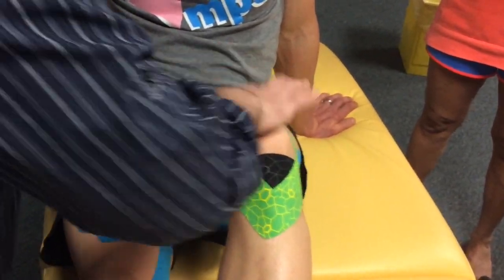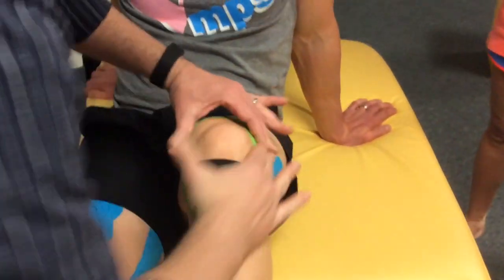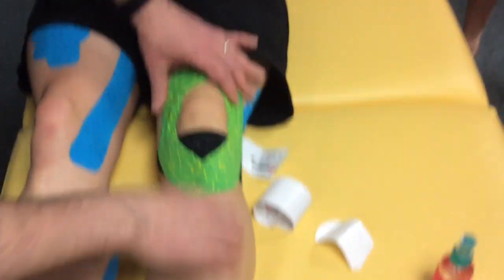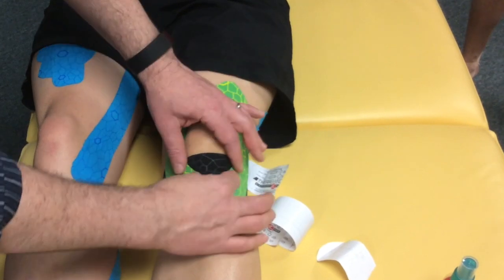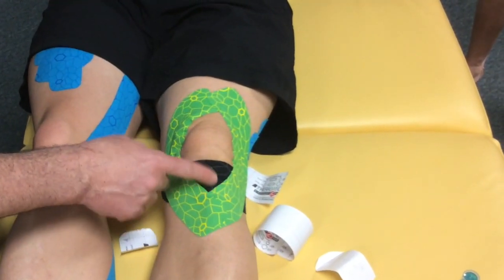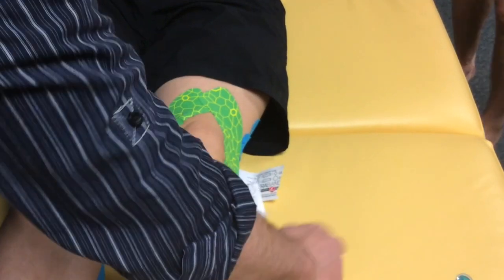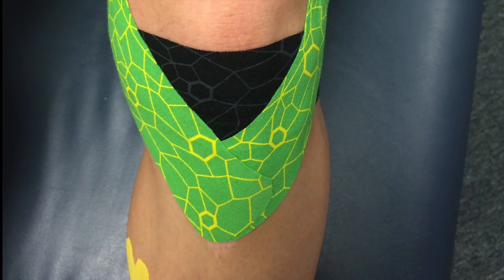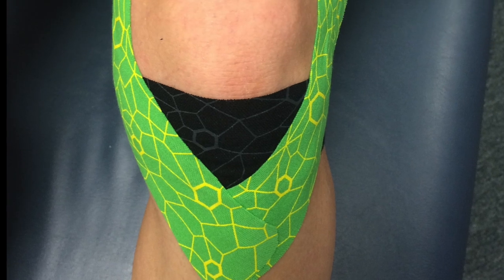These I-strips will provide a really nice proprioceptive input and support for the patient. Once applied, be sure to activate the adhesive prior to moving them back to a neutral position. The primary relief will be felt just below the knee where they are complaining of their pain. Remember, they should not engage in any rigorous activity for at least 15 minutes after the taping, assuring a good adhesive contact.